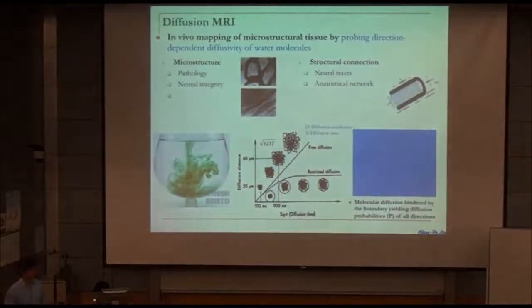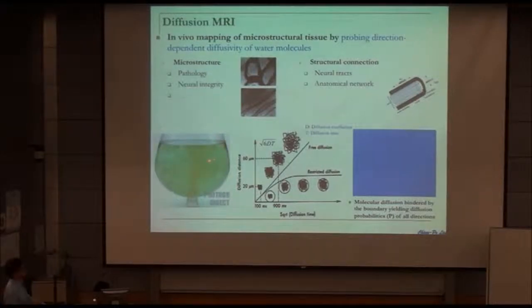And the basic idea of this technique is, for example, diffusion. We can see a dye when we drop the dye into a cup. Then after a couple of seconds, we can see there is some diffusion. So following the time changes, we can see the limitation of the environment. That means the diffusion cannot happen outside. So you can see the diffusion is limited in this environment and so on. But if there is no limitation of the environment, then we can see the diffusion just changes. That is a kind of short distance change following the Einstein rule.